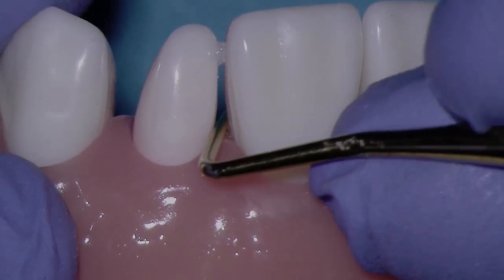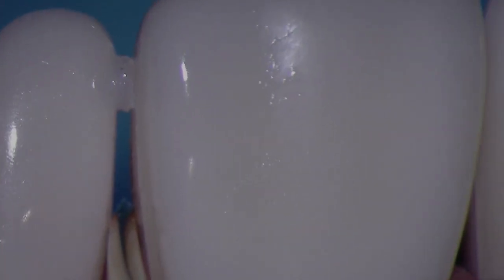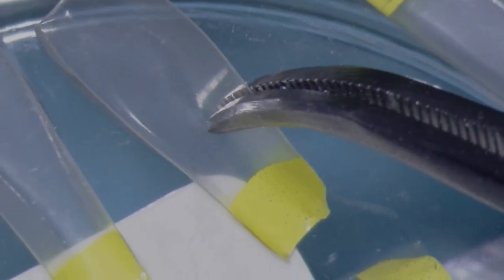Okay, let's go ahead and use the Clark Explorer. We want to use the straight end of the Clark Explorer. We're going to pry the teeth apart and make sure that we see clearance between the direct contact strut and the neighboring tooth that had the Vaseline placed. You can definitely see that I'm creating clearance. We can definitely see that we have a lack of adhesion on the Vaseline tooth and good adhesion on the peg lateral.